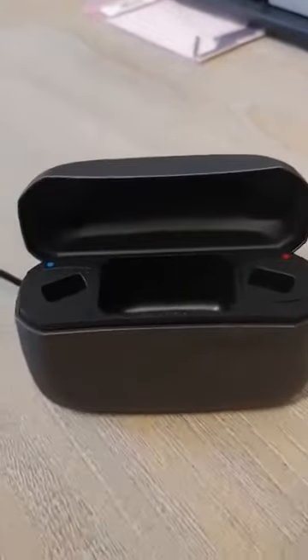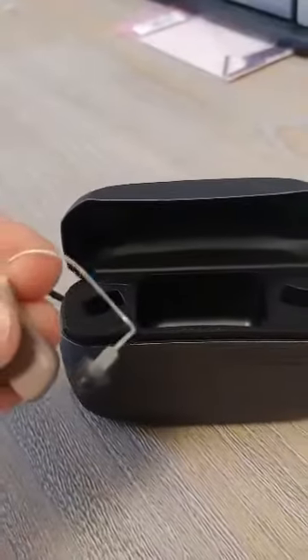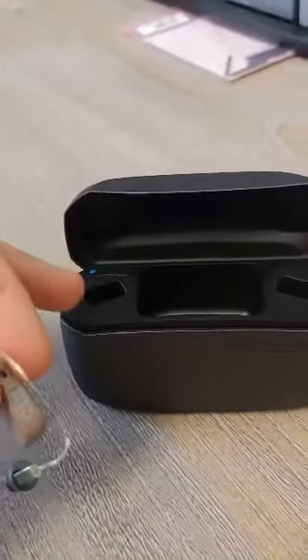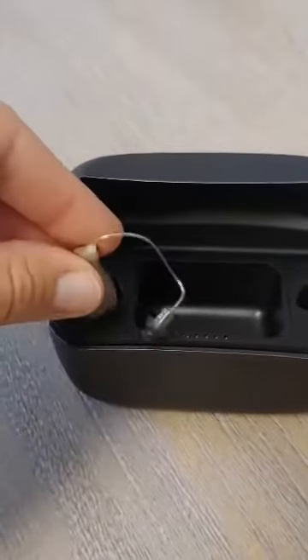Here is your charger. You'll want to keep it plugged in every night. When you take the hearing aids out, you'll see on the inside it has a blue dot. You'll want to line it up with the blue dot on the charger here. So you're going to rest this in. It just drops right in.